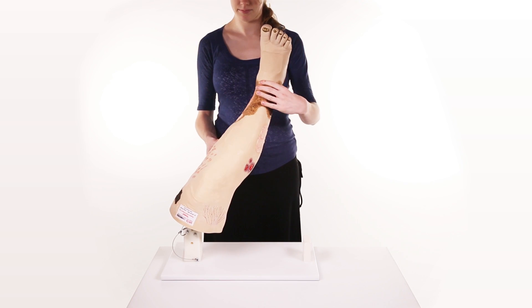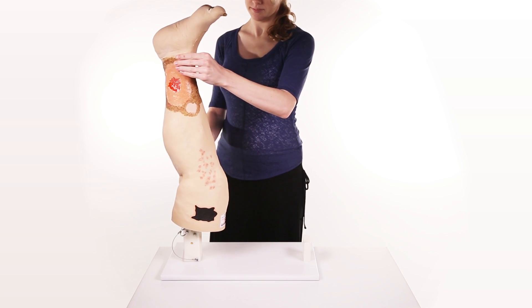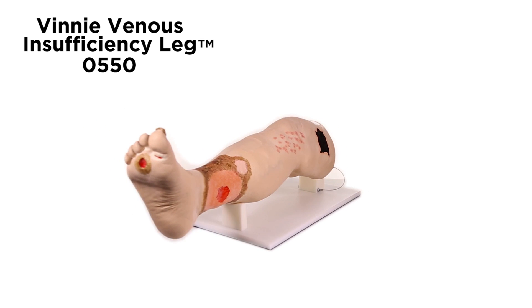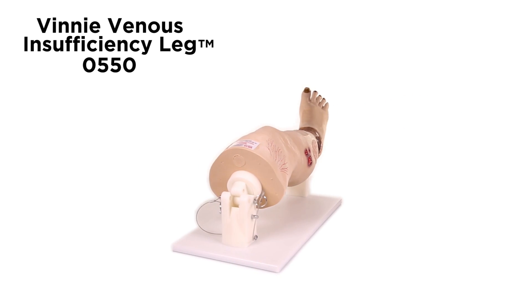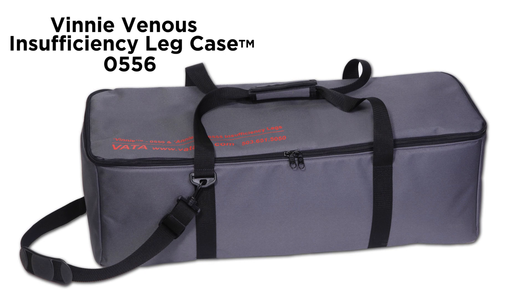The leg can also be secured in an upright position for great visibility in a class situation. Great care has been taken to color each wound just as you would see it on a patient. A great tool for identifying the various conditions, competency testing, and skills assessment for healthcare professionals. An optional carrying case, model 0556, is also available.